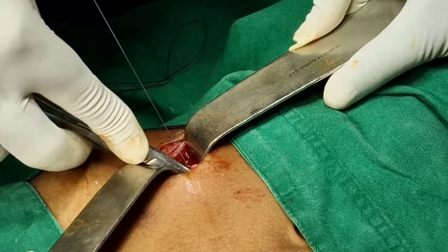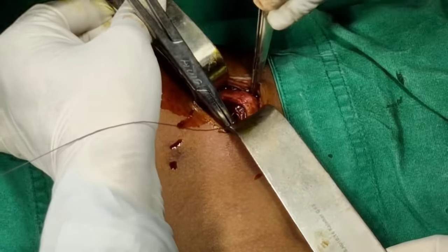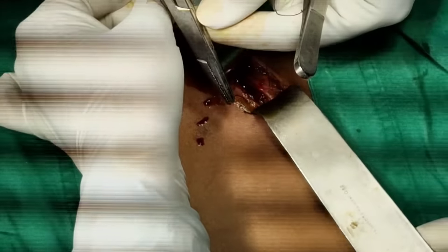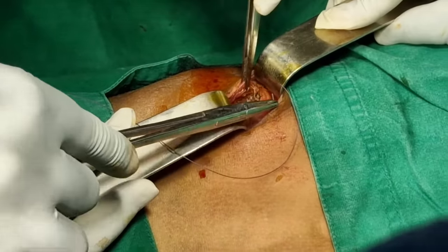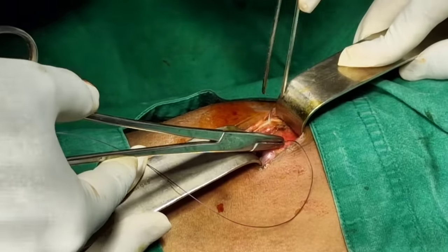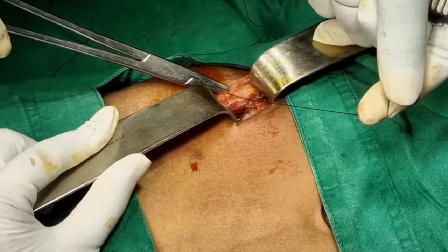After peritoneum closure, close the internal oblique and transversus abdominis muscle with simple interrupted sutures. Care must be taken that the suture should not be too tight — just approximate the muscles so that blood supply to muscle will not be hampered. The muscle is just approximated, not too tight. After this, close the external oblique muscle in the same manner — just approximate it, not too tight. Here it is being sutured with simple interrupted sutures. The suture material is Vicryl 2-0, which is absorbable.